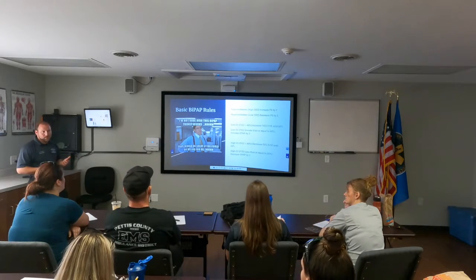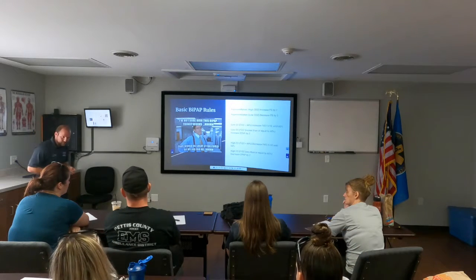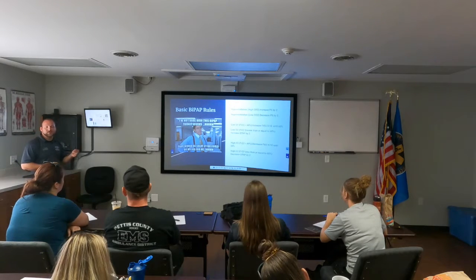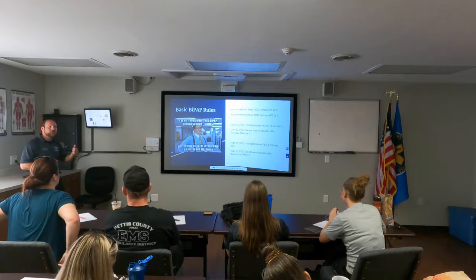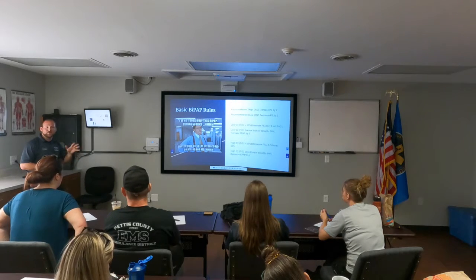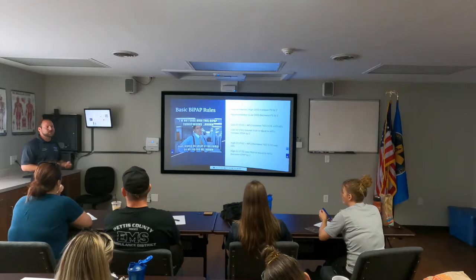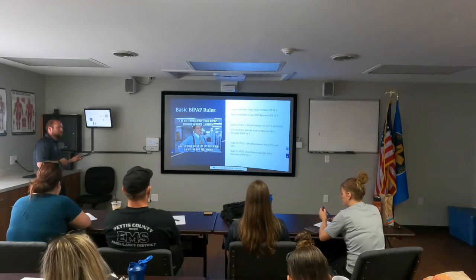And if you say increase the EPAP by 2, we're increasing the PEEP on our ventilators, correct? Yeah, that's correct. Like I said, anything that we do as far as our modes, whether it's tidal volumes, do it by 50, small increments like that. If you're doing our peak inspiratory pressure, where we actually talk about the upper airway pressure, by 2. PEEP, same aspect of that.